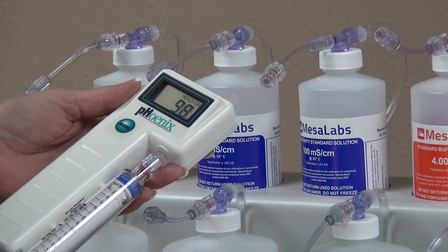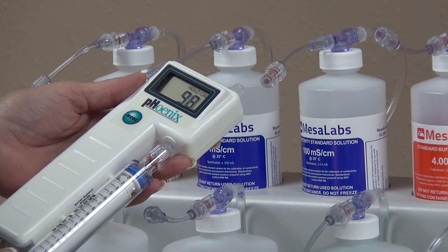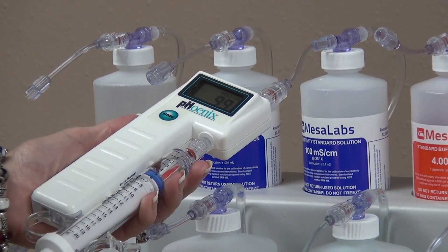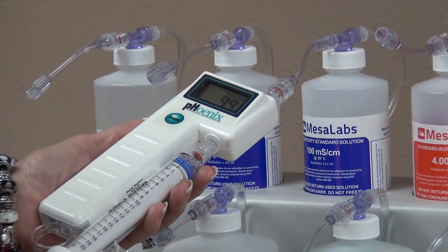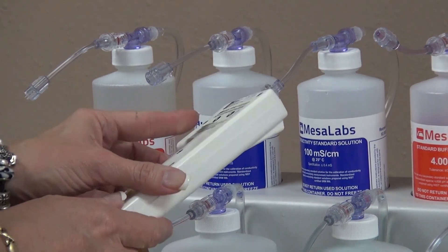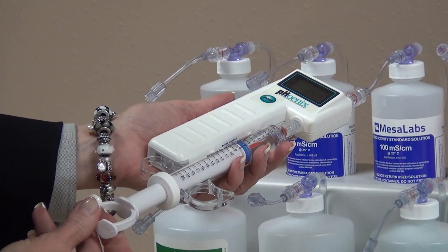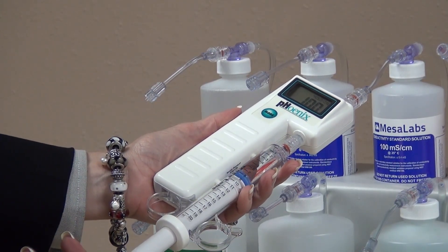Next, adjust the high conductivity range, which is 20.0 through 199 mS. Connect the Phoenix Meter to the 100 mS solution. Initially flush through the cell, then observe the reading while drawing solution through the cell. When the reading stabilizes, press the up or down switch to adjust the displayed value to 100. Expel the 100 mS solution and draw a fresh solution to confirm the accuracy of the displayed reading, which is 100 mS.